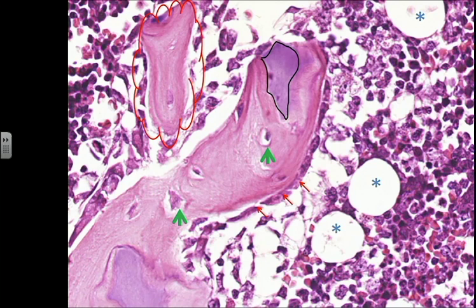So in children, particularly under the age of 5, during infancy and up till the age of 5, their skeleton is transforming into bone from the cartilage, but there can be some remnants of the original cartilaginous skeleton hugged within the bone matrix. So this is a clue to tell me that this is in a child.